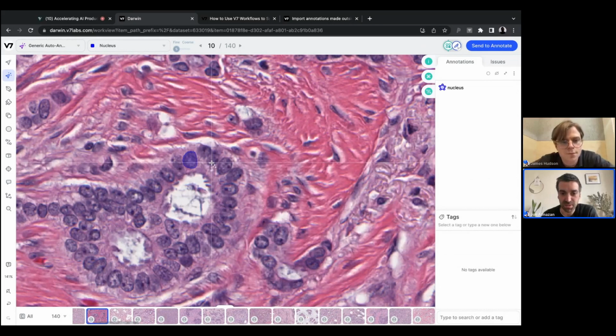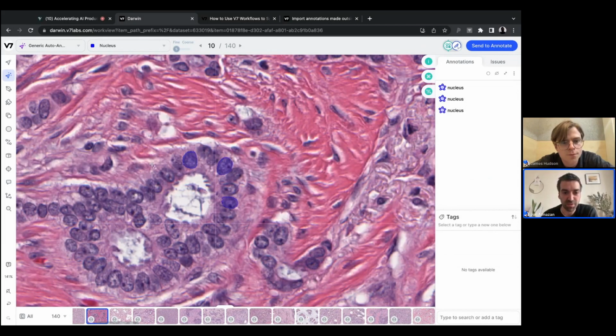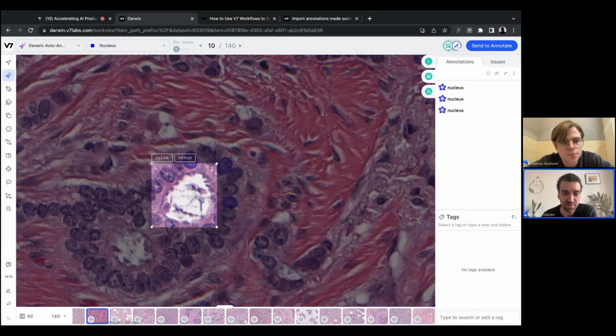You can keep annotating examples like this, but it also works on things it has never been trained for, like segmenting nucleus. So it's a pretty generic object segmentation tool. So you can, for example, run it on different objects. You want to segment this. You can even correct it. This part is missing, so you can add it and make corrections or remove parts.